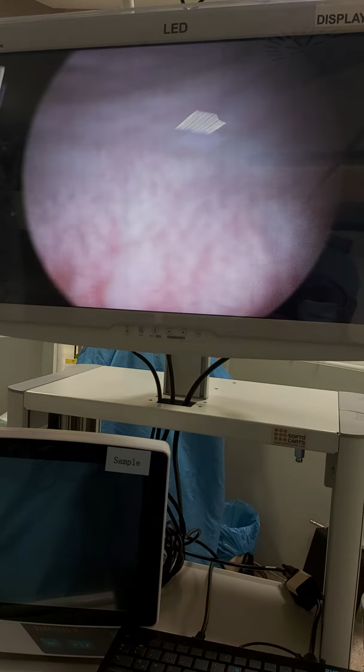In some parts, for example here, there is not too much abnormal tissue, so I don't need to make it deeper. Just the superficial fulguration for the tissue to recover itself, to let the new tissues grow over the abnormal tissues. Then I clean the tissue remnants. Still there is a little, look, this is normal, this part is red.